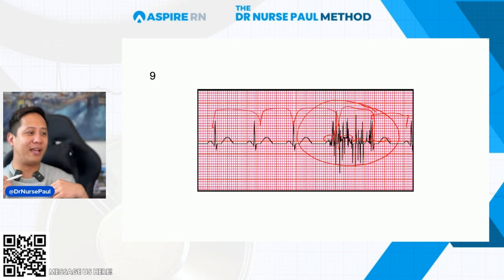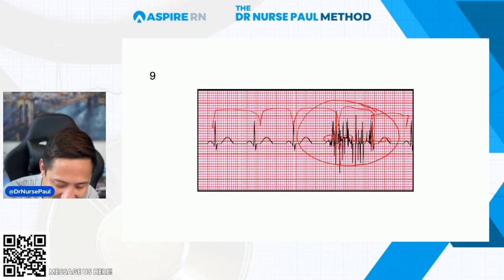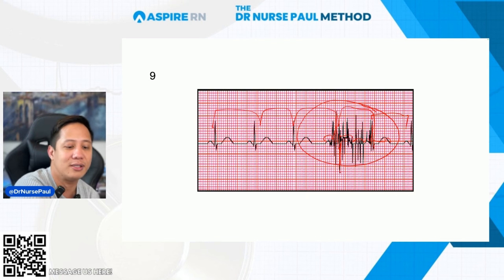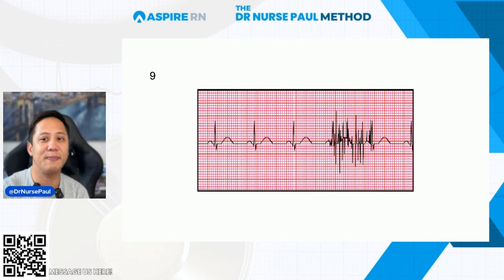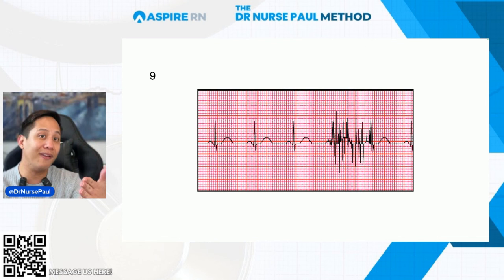The patient's moving. That's not paroxysmal. You see those straight lines? That's called artifacts, guys. I'm going to clear it so you can see it properly. You can see the PQRST behind it. The rule is check completely or carefully. You see the waves behind it. It means the patient's moving or the leads are off. You got it? Artifact. That's not paroxysmal.